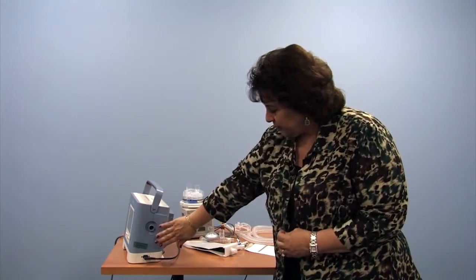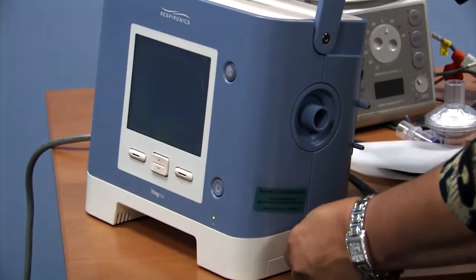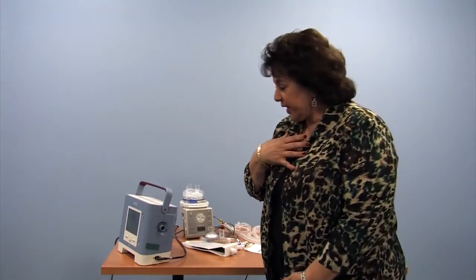You can see on this other side of the machine, we have our main power plug that goes right to the wall, and we have the gas outlet where the air comes out to go to your child's mask or tracheostomy tube.